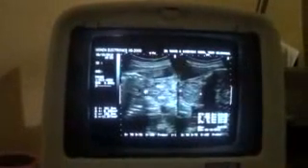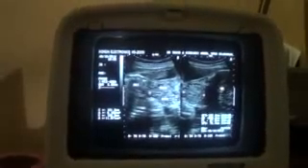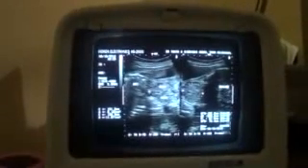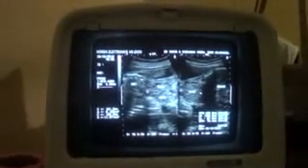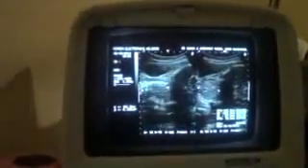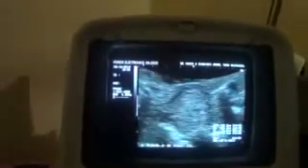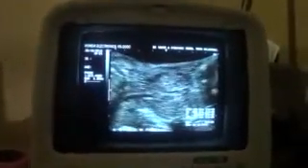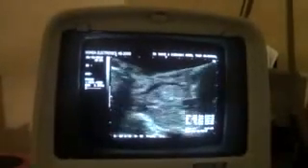Now this is the heart, this area. This is the brain. I am saving the image for further study for myself. Now, I am going to magnify this mass, and then I would like to study and see it's a bilobe shape of a mass with a vessel passing through the center of it. There we are.